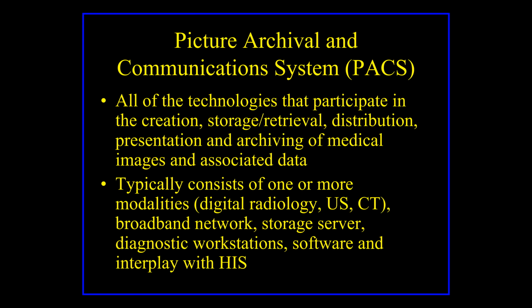Okay, PACS and DICOM. PACS is an acronym that stands for Picture Archival and Communication System, and medically, that's how all medical images are stored and cataloged on your computer. Inside your computer you'll have basically a mini PACS, so you can type in Fluffy, type in pelvis, and pull up the dates of every pelvis you did on Fluffy, because it can search and catalog all of the images you have.